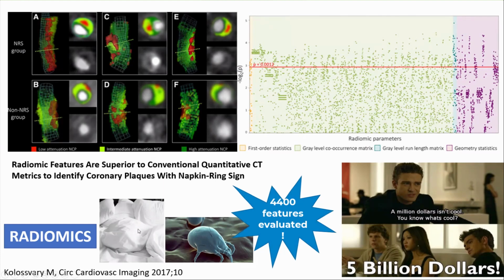So just like you can't see dust mites, they can still harm you. Just like you can't see things visually in certain plaques, they can still harm you. But we now have the tools with radiomics and AI analysis to actually extract that data that we can't see and identify risk.